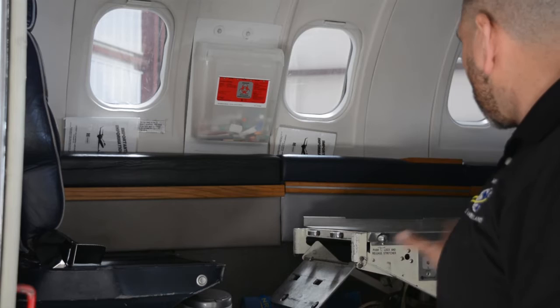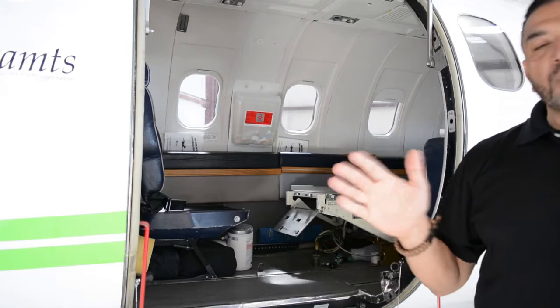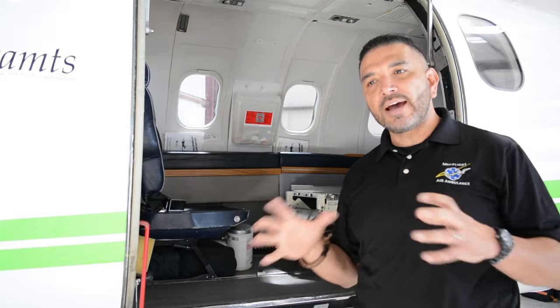Again, making sure that your oxygen is on and that you have your regulator ready to go if that patient is on oxygen, or that you have the proper hookup to plug into the oxygen. One other thing I want to point out, if you're using your first-in bag, make sure that's set out, that we have the equipment that's going to be essential. Make sure you are thinking about the logistics of what needs to be out.